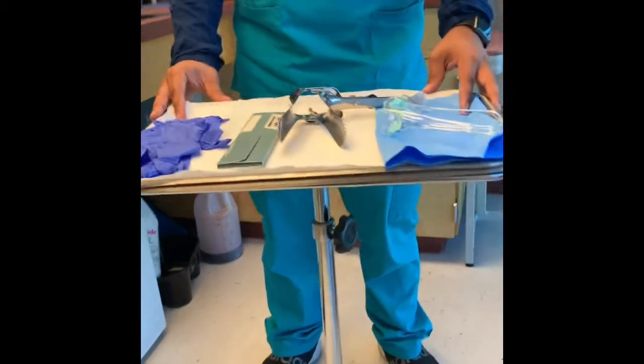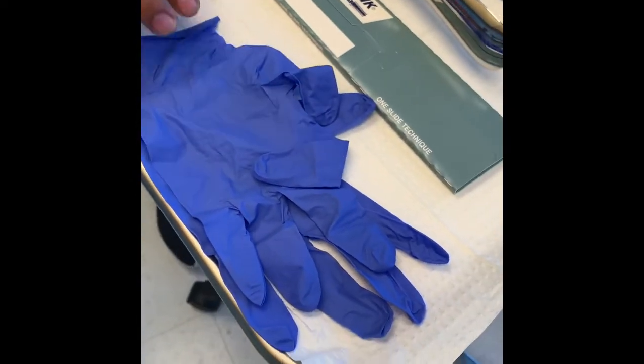The first thing you do need is the pro gloves, which is right here. It doesn't matter the size, it doesn't matter the color.